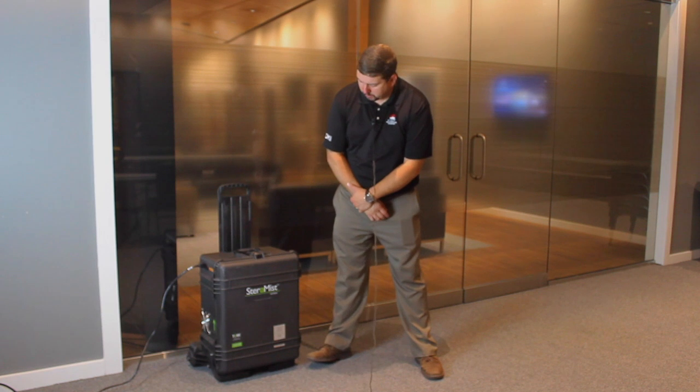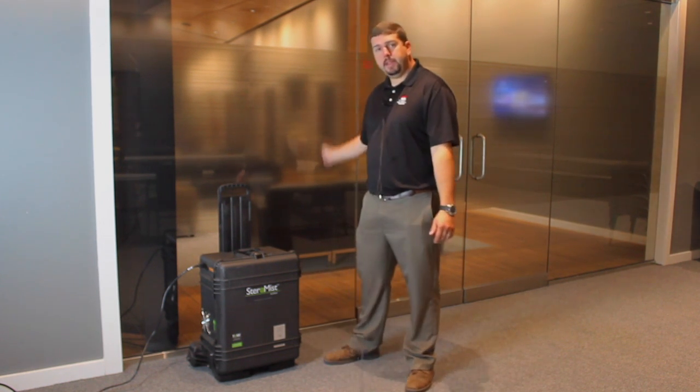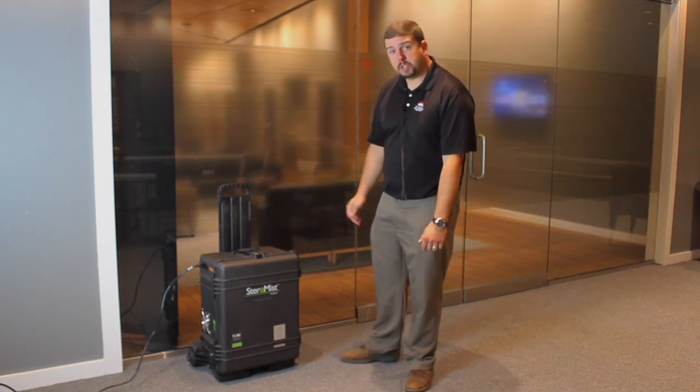Hi, I'm Matt Knoll, the commercial account manager here at First Restoration Services. Today we're going to go over the Stairamist surface unit. There are three things we're going to cover: the setup, the application, and then the pack up. All of that's going to be done in under five minutes. So let's get started.